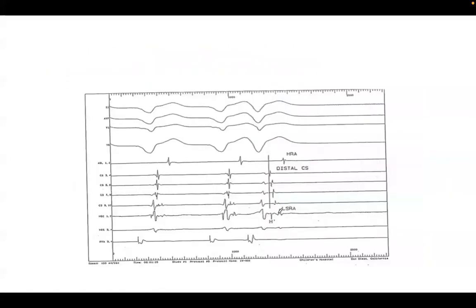Okay, for example, this is a patient who they are V-pacing here, and you see earliest A roughly in 7-8. Do you guys agree, earliest A maybe in 7-8 in this case? Everyone agrees? Yes, it is okay, 7-8. You know it's not normal, right?